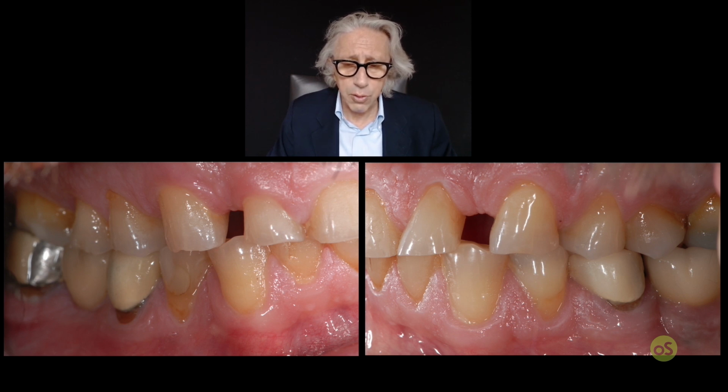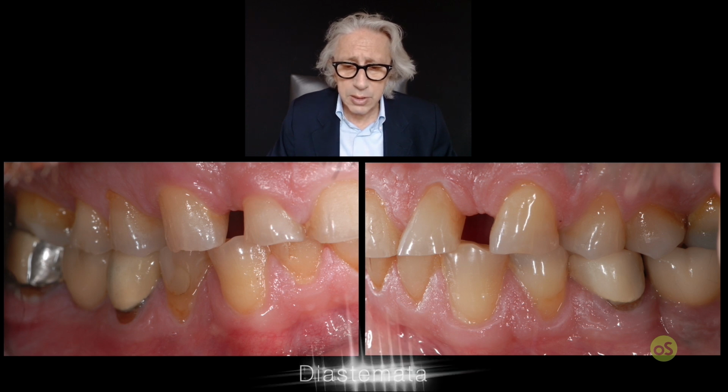It means if it's possible to close the diastema or to do ortho before doing any pros. Of course, ortho is always the first option, but many times the patient doesn't want orthodontic treatment before pros. In this case, we try to see if there is any chance to close the diastema anyway. You can see the lower arch. On the right side, we have a bridge. On the left side, we have 3 implants in the posterior area. So we have to close the diastema, as we said.